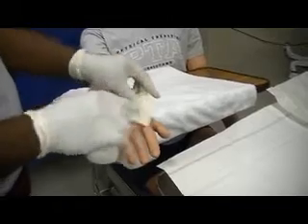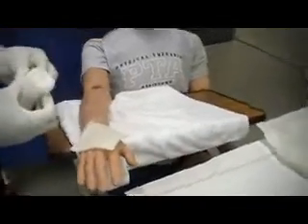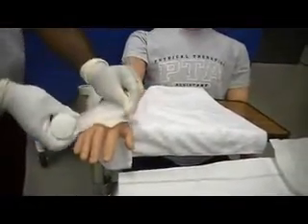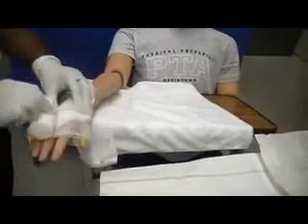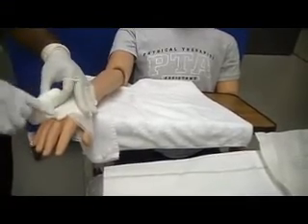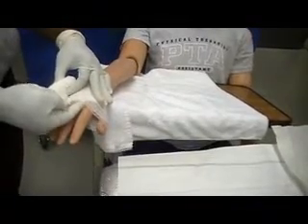So we want to place it right over top of the wound, and then we want to make sure that the complete area is covered, where all parts of the 4x4 are covered completely. So I want to make sure that this here is not sticking out, because contaminants could get into that area.